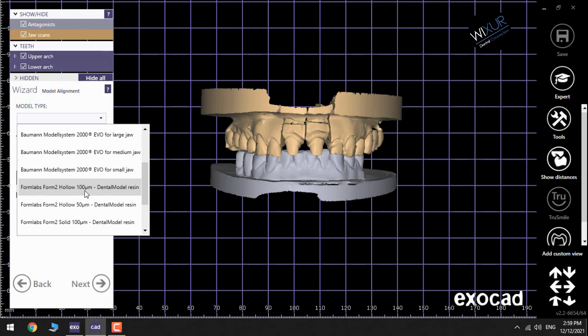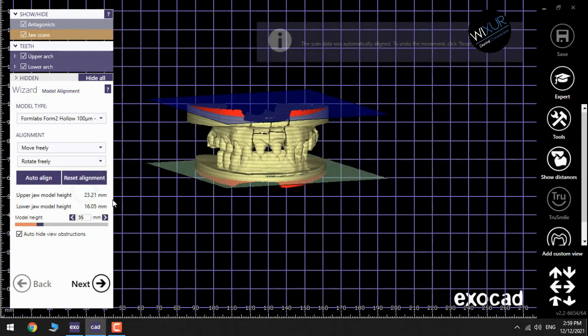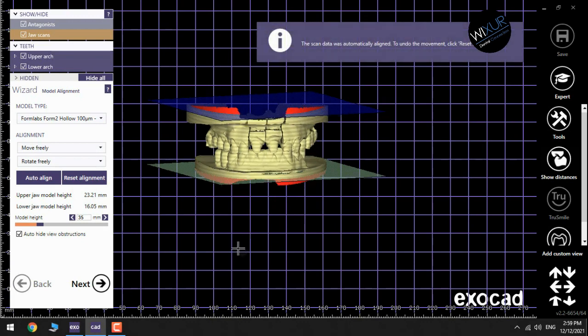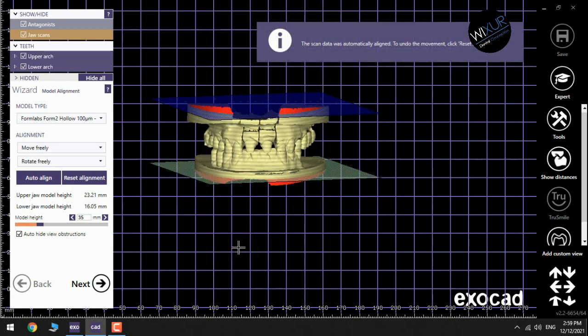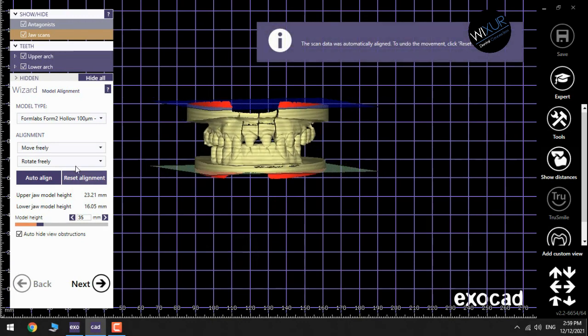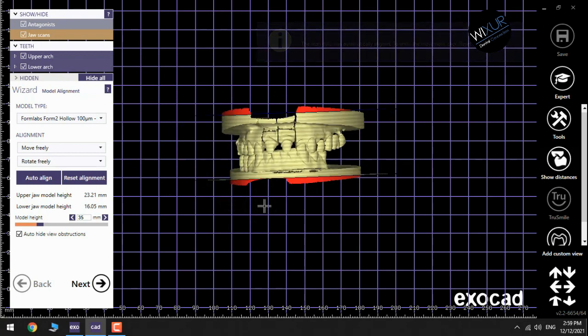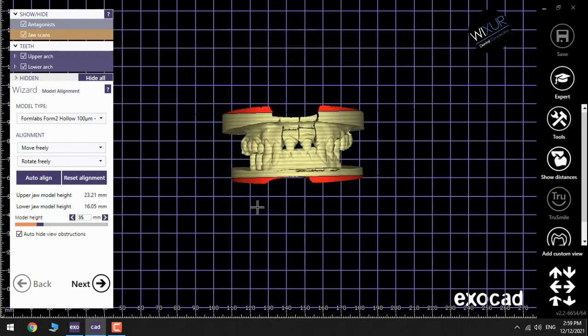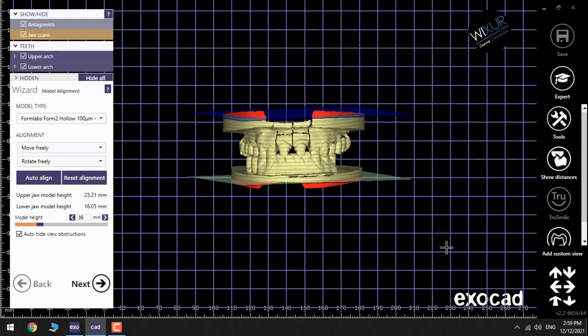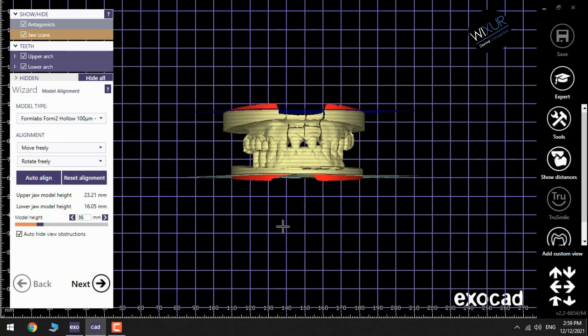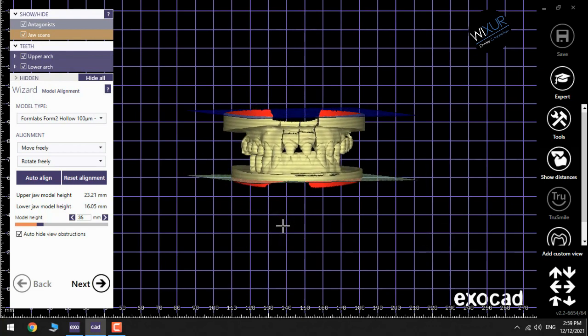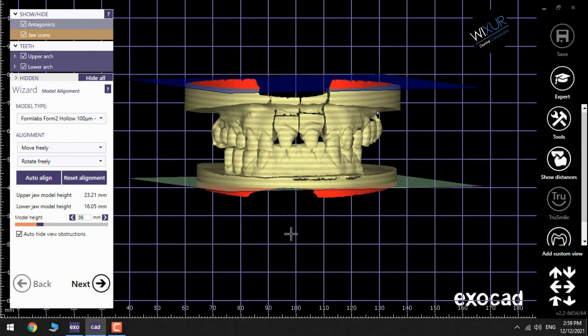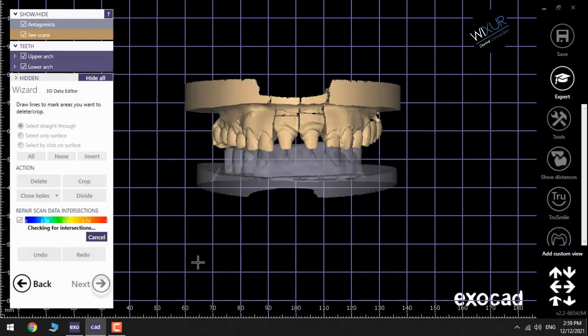Now it's time to align the model. You have some choices that are default: Move Freely and Rotate Freely. I leave it like that because it completely looks good. Click Next.